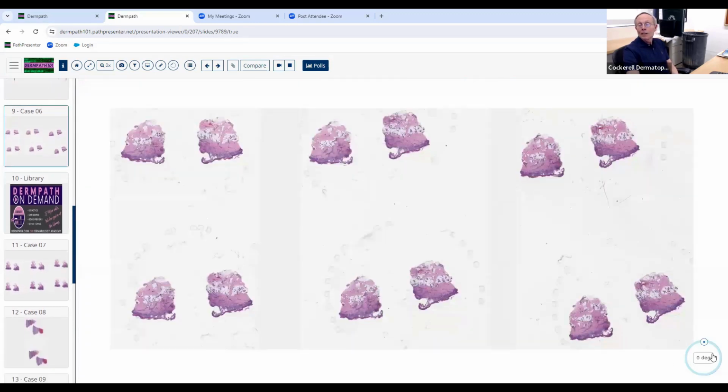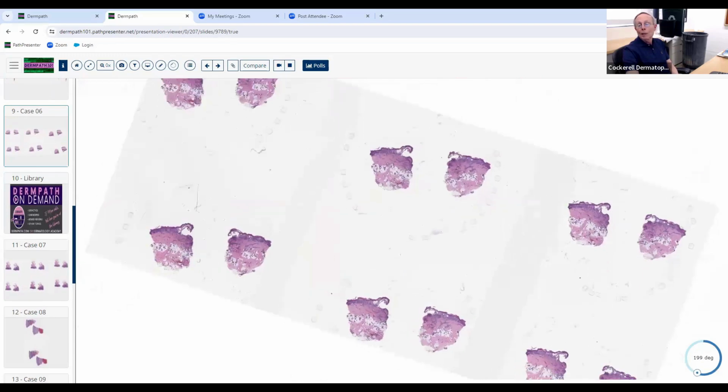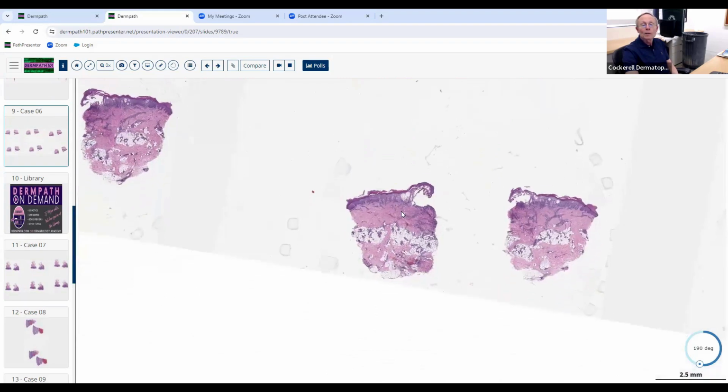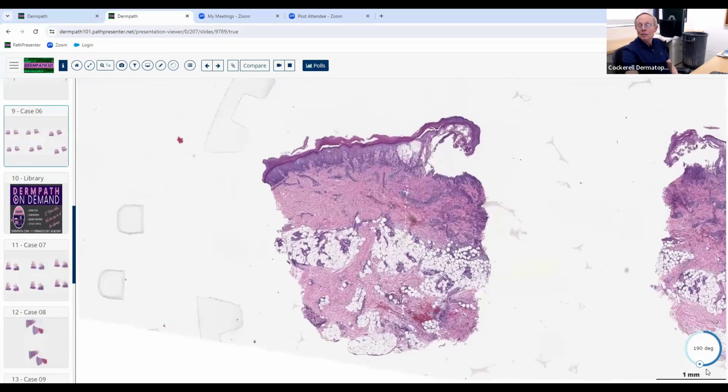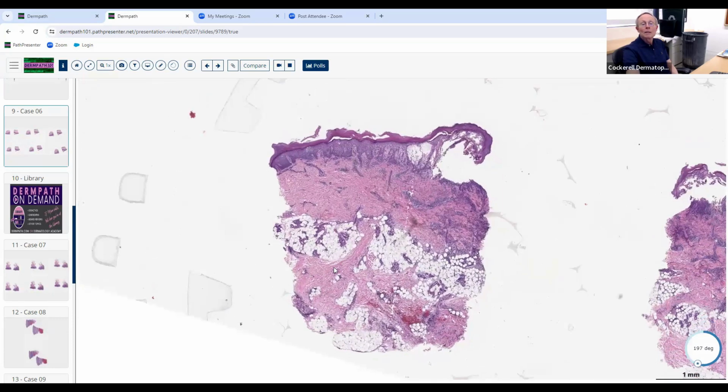Okay. This one gets a better grade because they took a punch, thank goodness, which we like for punch biopsies of inflammatory skin disease. And this is nice because you're getting a little mini theme today of ballooning degeneration. Now we can see the whole thing, right? An excellent punch biopsy. We've got a superficial and mid to deep infiltrate. These cells are dark. They're going to be mostly lymphocytes.